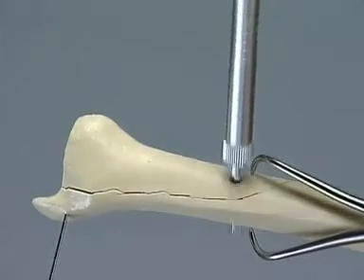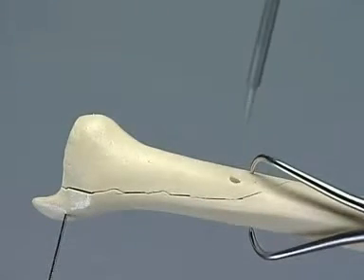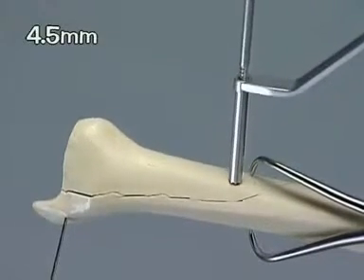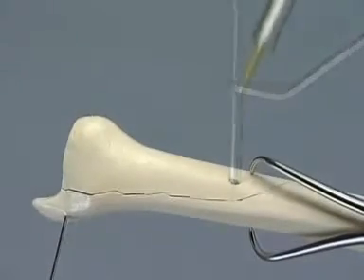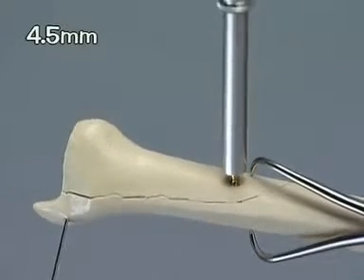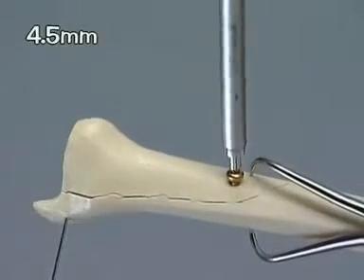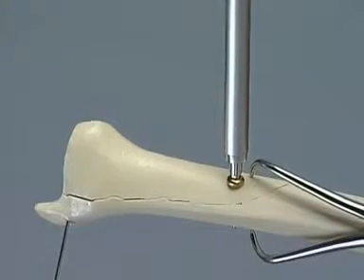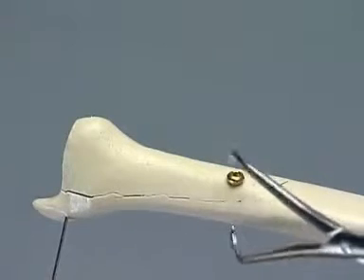Measure the depth. Tap with a 4.5 millimeter tap. And insert the 4.5 millimeter cortex screw. Interfragmentary compression of the fracture is achieved. The reduction forceps can now be removed.